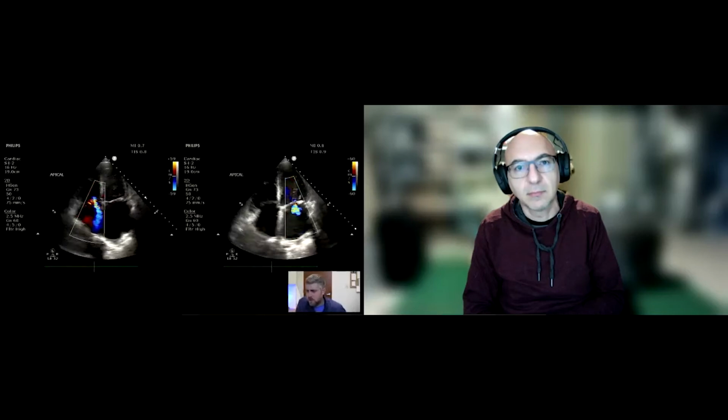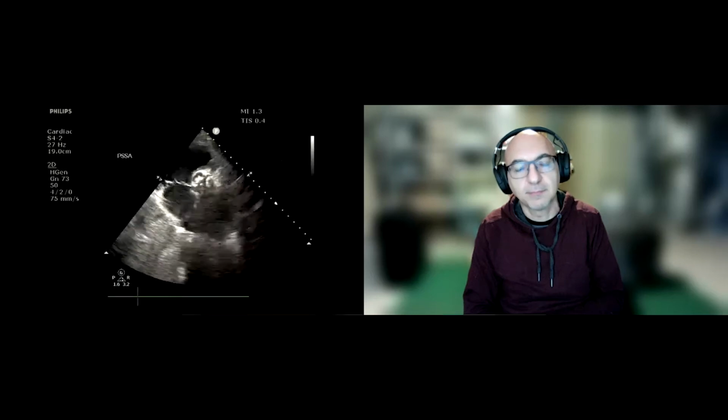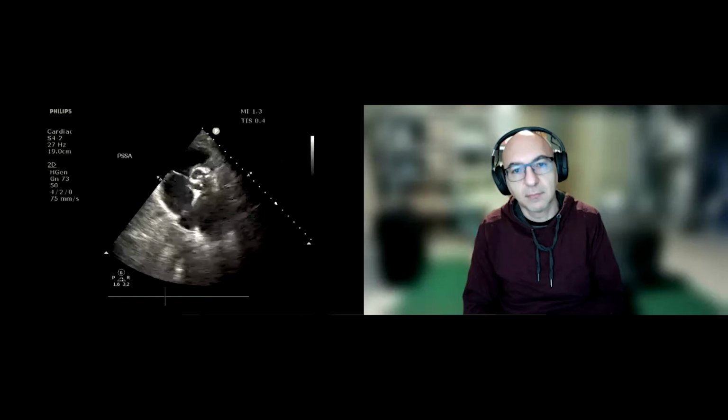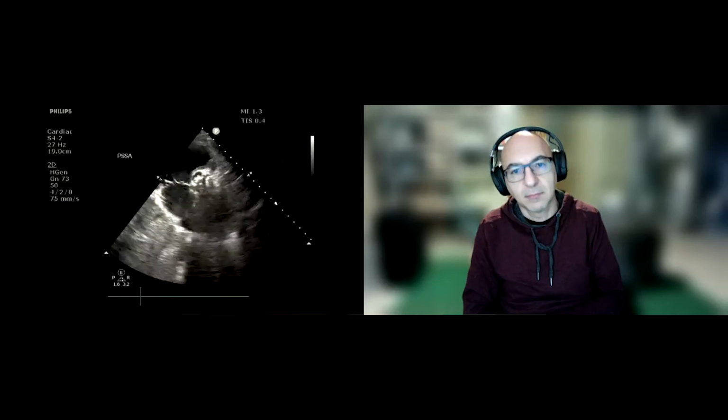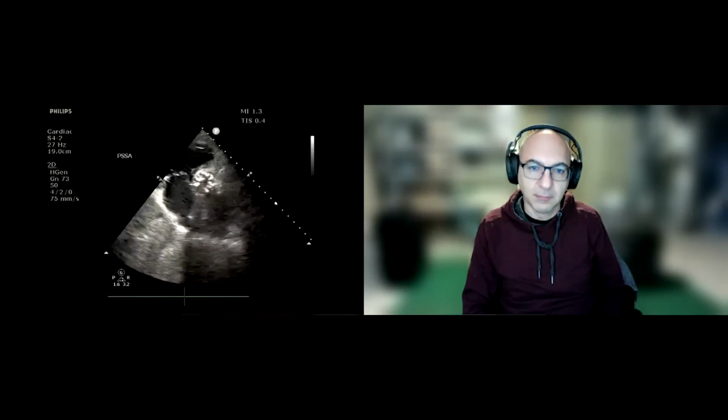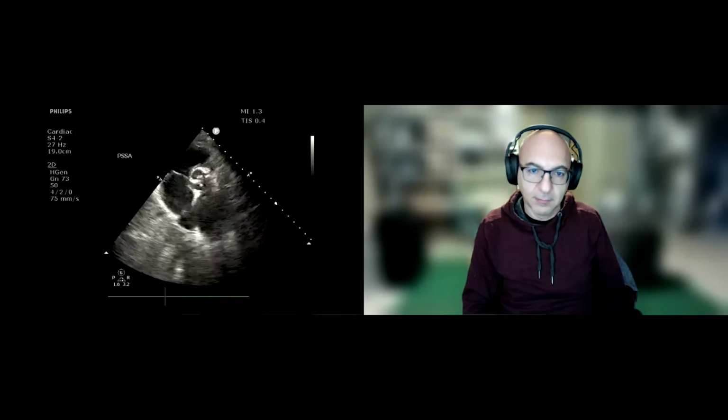The other part of the valvular assessment that we looked at is basically their aortic valve. Here's a short axis view of the aortic valve. I wasn't able to get any good Doppler views through it to get a Doppler waveform. But essentially what we see here is a really, really tight aortic stenosis, so this would be that severe to critical aortic stenosis level of tightness. There are parameters you can put on that, such as Doppler velocity through the valve and valve size, to figure that out. But I'm just going to tell you it was severe AS. And here's a representative clip of that severe AS.